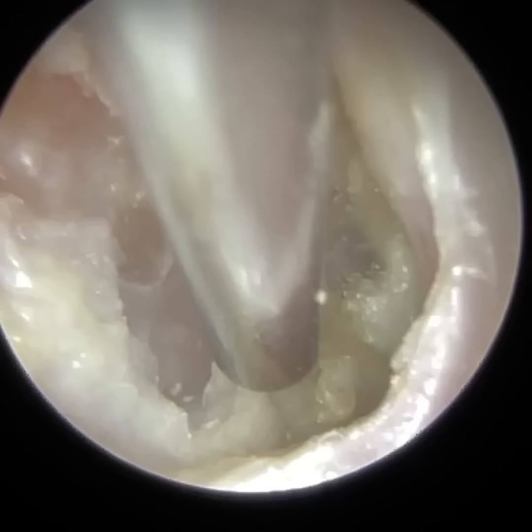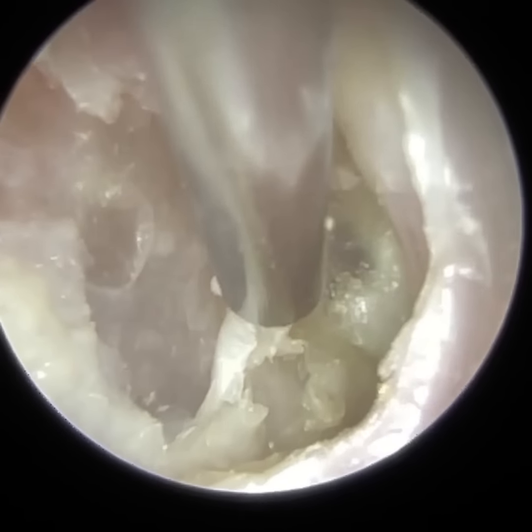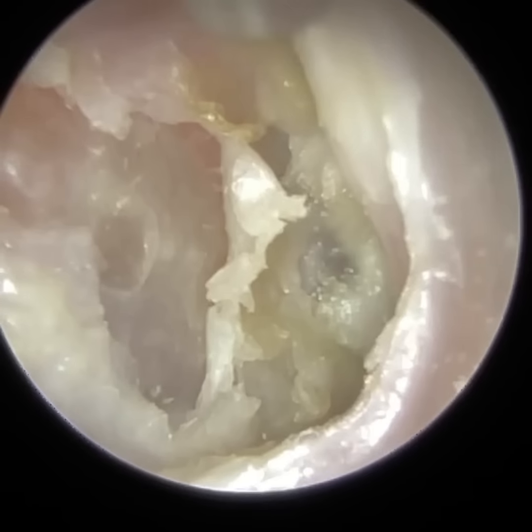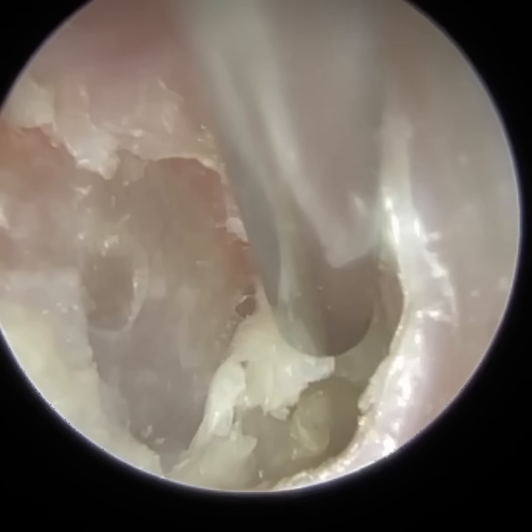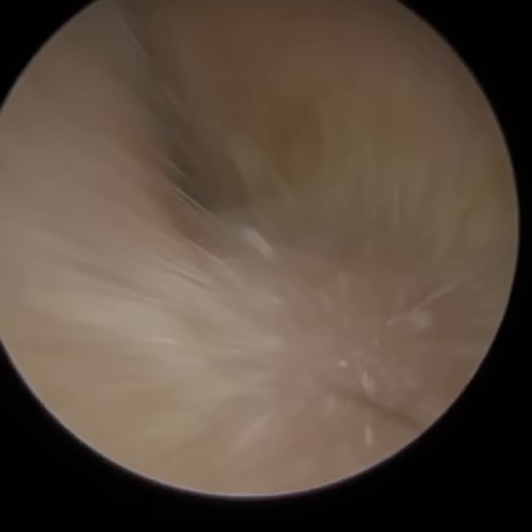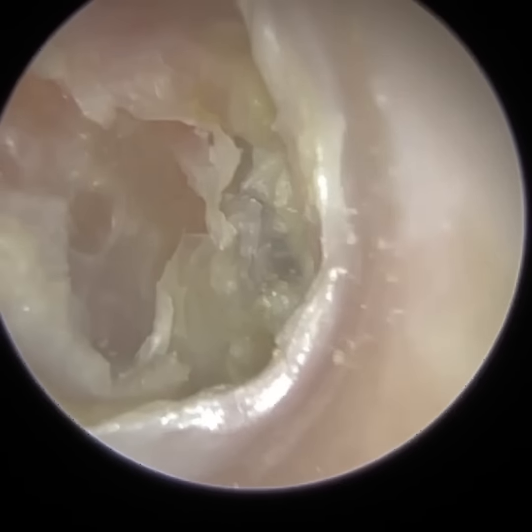You can get different sized fine ends, but the normal one is 18 gauge, which, if memory serves me right, has an outer diameter of about 1.28 and an internal diameter of about 0.83. But I'm now using a 17 gauge fine end, and the suction tips I use are completely different.